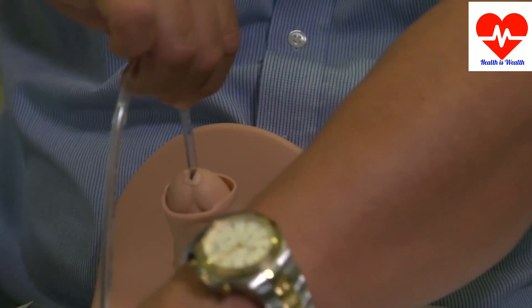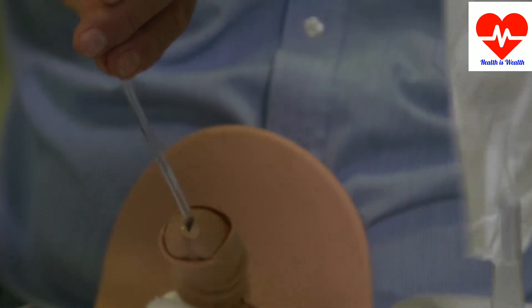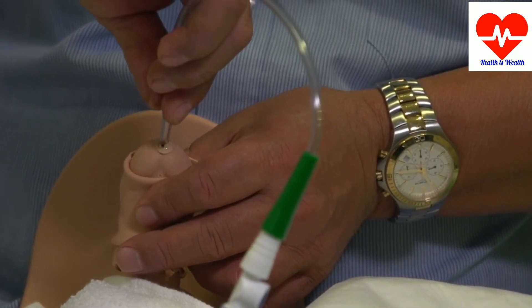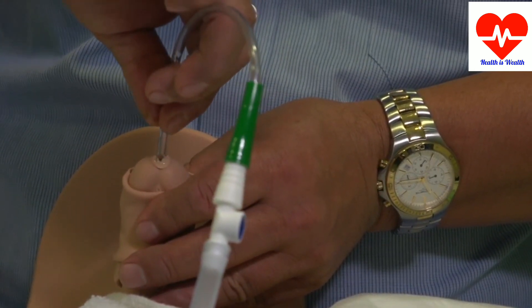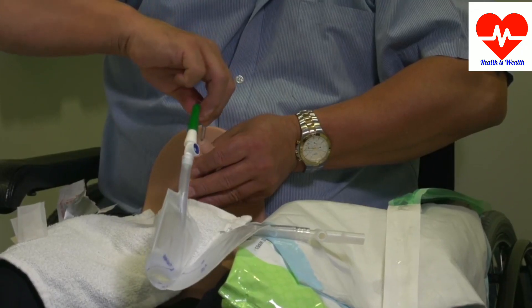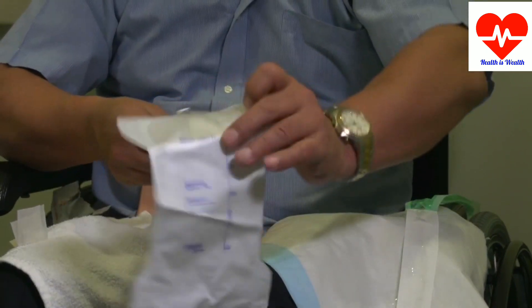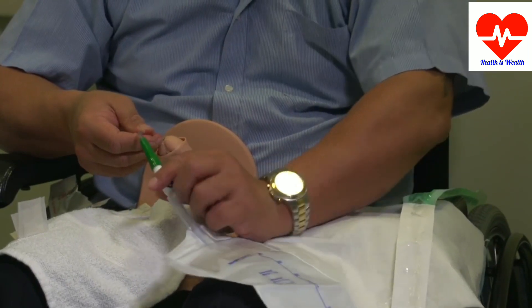Once you've started to insert, you can use your non-working hand to set the bag up. Continue to gently insert until you feel the urethral sphincter. Once you feel the urethral sphincter, apply slow, gentle pressure as you go through the sphincter. Once you are through the sphincter, you will see the urine draining through the tube. You can then hold onto the catheter so it doesn't pull out, and stabilize your bag so you can watch the draining of the urine.